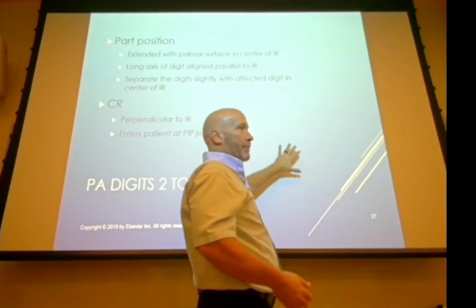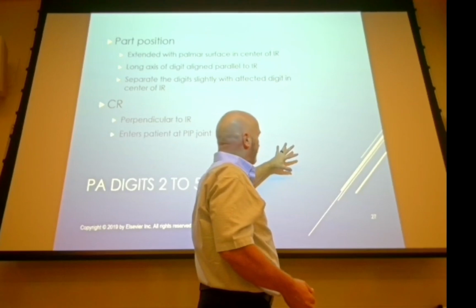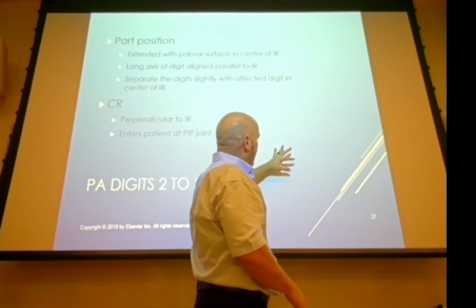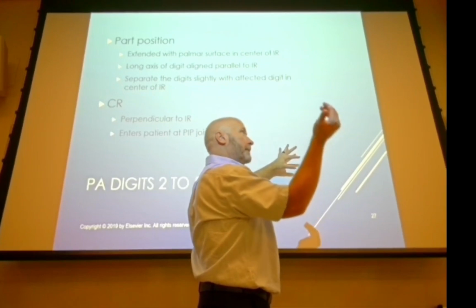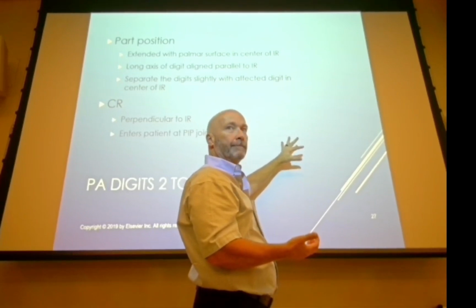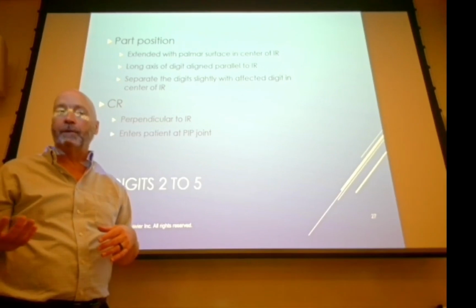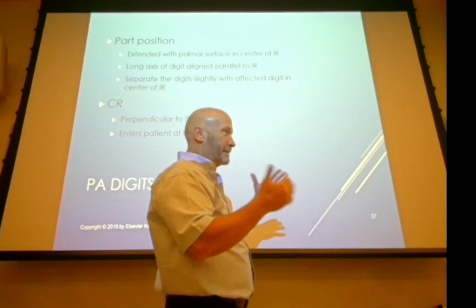The other option is what we refer to as a fan or an oblique. It is a fan, but we usually refer to that in the lateral. But to keep the fingers parallel to the image receptor keeps the joint spaces perpendicular and therefore parallel to the central ray, and we can see the joint spaces if we stretch fingers out. Okay, so whichever one your hospital goes with is fine. Doesn't really matter. In both cases, what's our degree of obliquity? 45. Exactly. So then our lateral kind of follows the same trend.